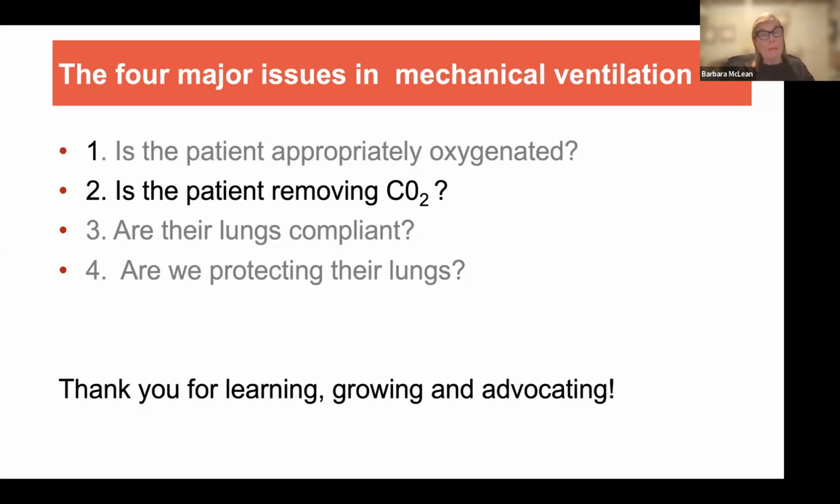And we're going to measure that in the most primitive way with the P to F ratio, which we have discussed before. Is your patient removing CO2 and are we protecting their lungs? That's going to be about tidal volume, respiratory rate, i.e. minute ventilation, and flow rate, making sure that you shorten the inspiratory time to allow more time for exhalation, but you can only do that because you're going to slam that gas into the lung if the lung is compliant. And remember that we look at lung compliance in the most primitive way. We start with that peak pressure, and then we do a plateau pressure, which traps the gas in the lung, looking at the functional alveolar surface.